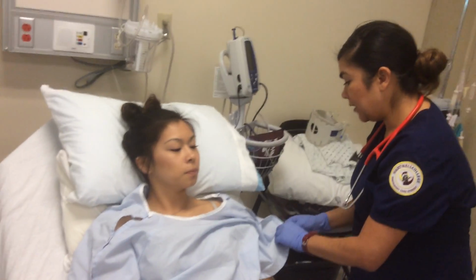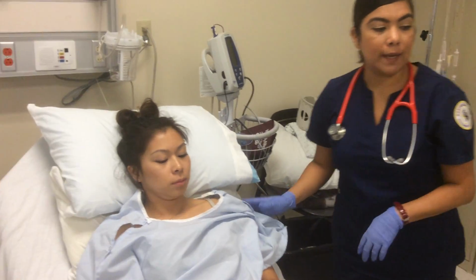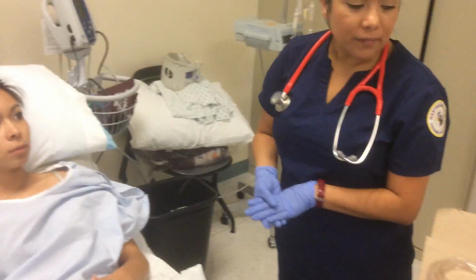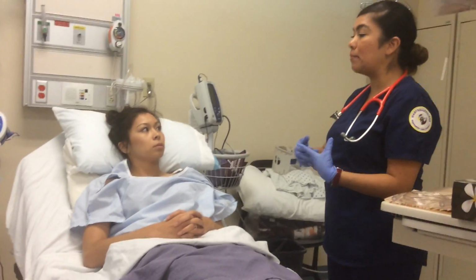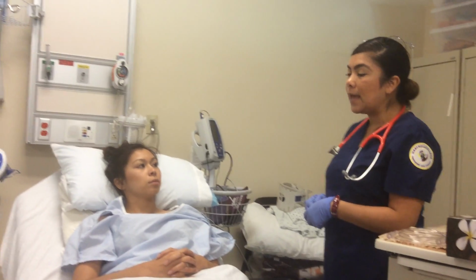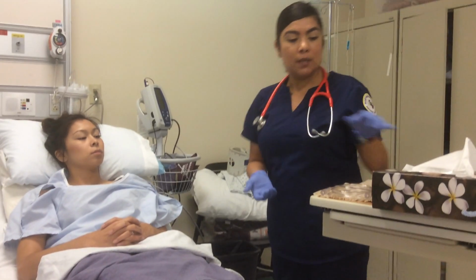Okay. Are you feeling dizzy or anything? No. Okay, very good. Thank you so much. Okay, so prior to starting the medication, I am going to ask to have you perform a peak flow. And what that does is it's going to measure the volume, your tidal volume that you have in your lungs, okay? And I'm going to go ahead and walk you through it as well, but let me just tell you.